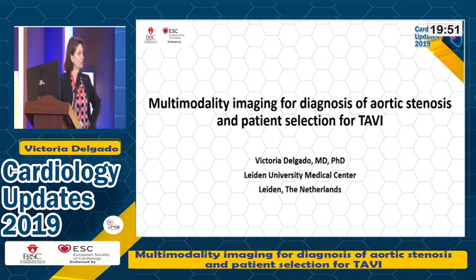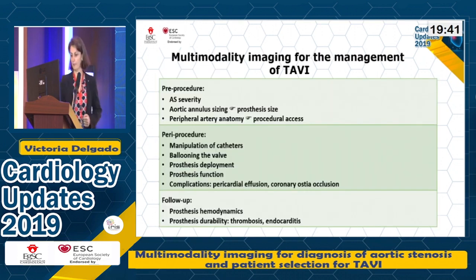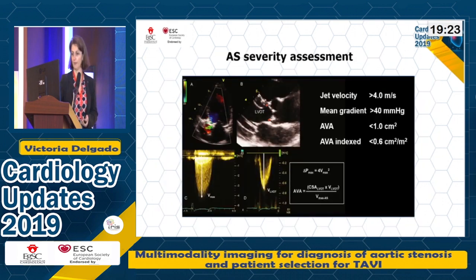So the last talk that I will give is multimodality imaging for diagnosis of aortic stenosis and patient selection for TAVI. These are my disclosures. Basically, I will try to concentrate on TAVI patients, and I will not go only for pre-procedural imaging and patient selection. I will also touch upon peri-procedural imaging and the follow-up, which I think is very important as well.